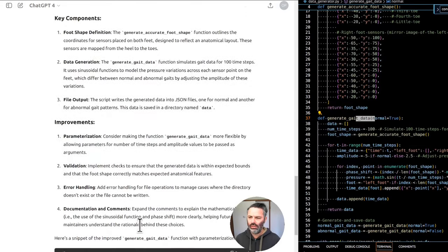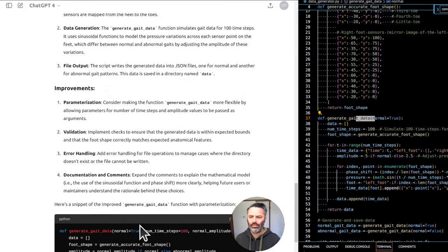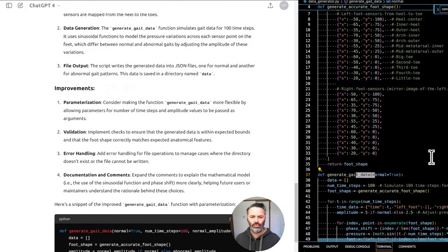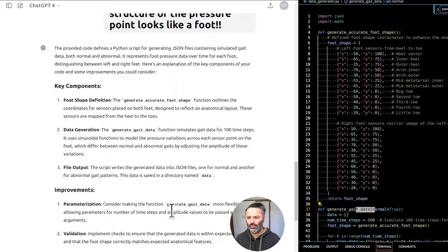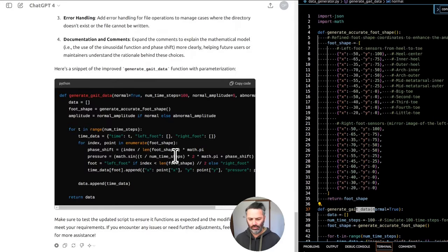Coordinates. The provided code defines a Python script for generating JSON files containing simulated gait data, both normal and abnormal. It represents foot pressure data over time for each foot, distinguishing between left and right feet. Here's an explanation of the key components of your code and some improvements you could consider.